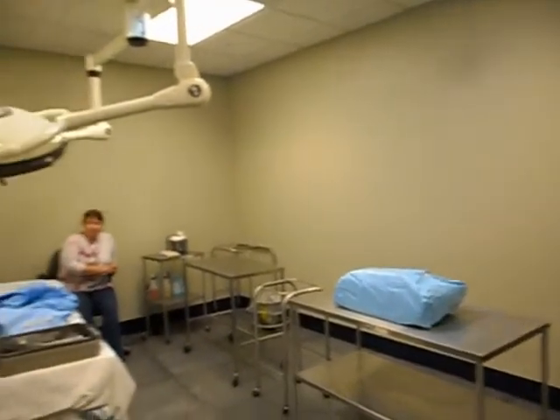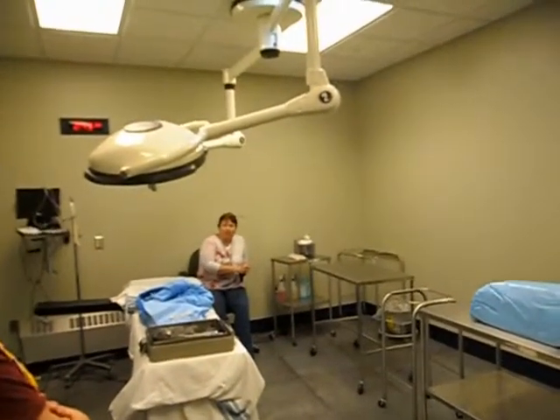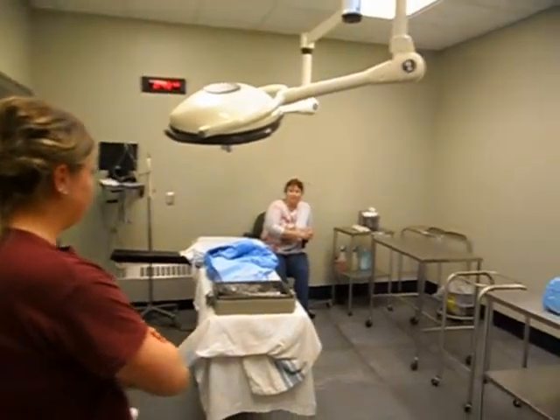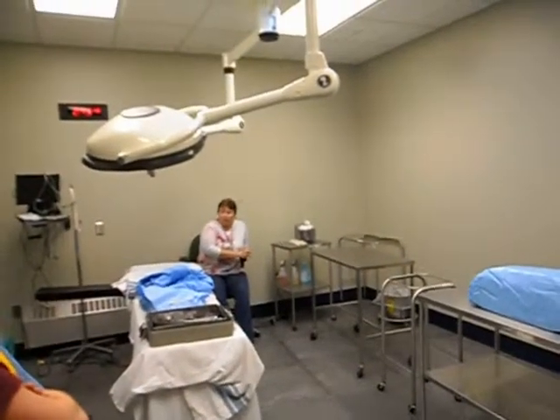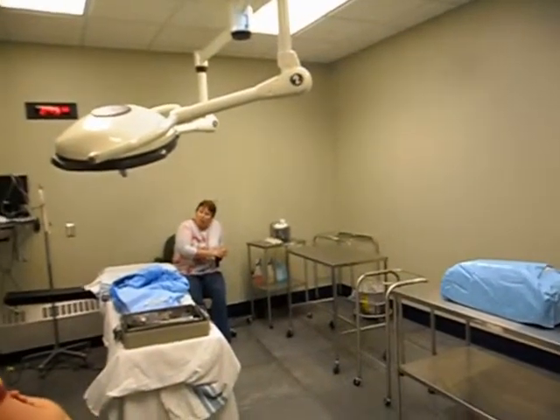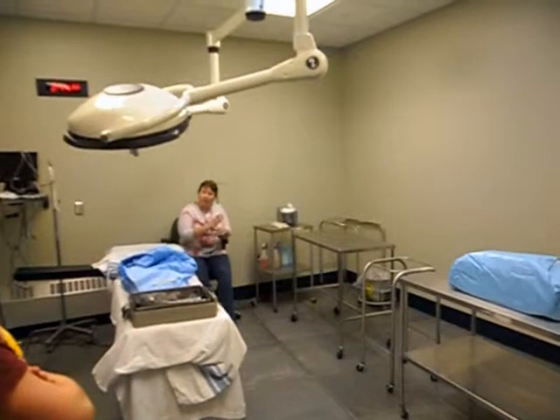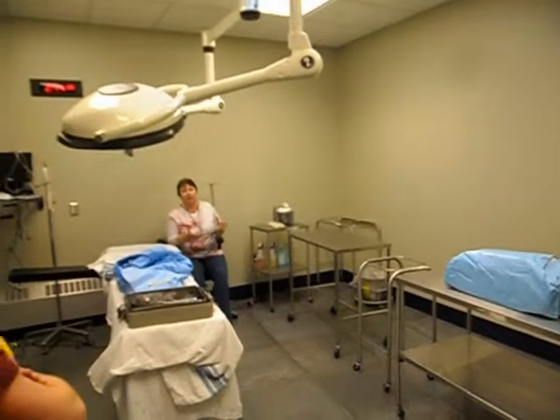Allison, what would our drape be? Just abdominal drape. Okay, what does that comprise of? For just draping out? Yeah. Four towels, and then just the drape afterwards? So four towels, with or without perforating towel clips, a lap drape, or we could use the utility drapes that have the peel and stick, or we could use a 2U system, 2U drapes, where we make our own fenestration. So it'll say on the card it's position preference. You may or may not use an Ioban.